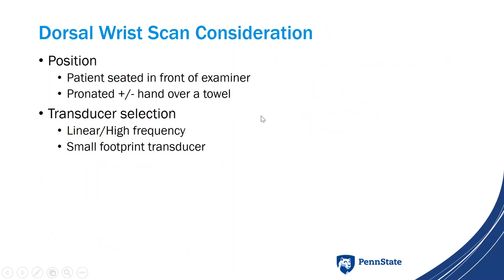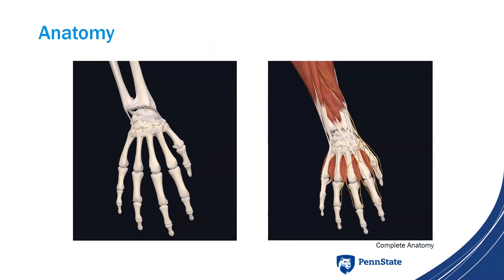For patient positioning, they're usually seated with their hand pronated on the exam table, with a towel for positioning if needed. For transducer selection, use a high-frequency linear transducer. A small footprint transducer is helpful, especially if you're planning a procedure.